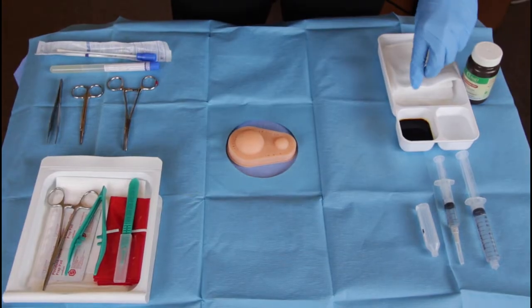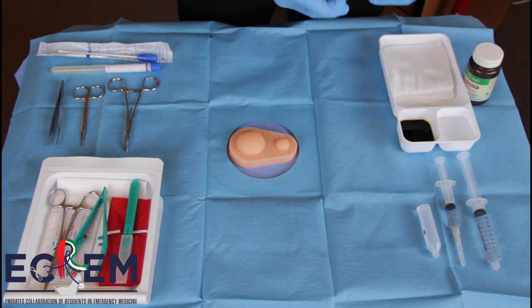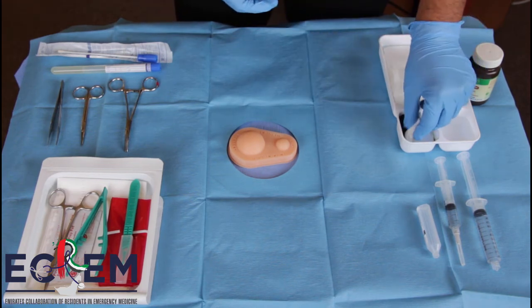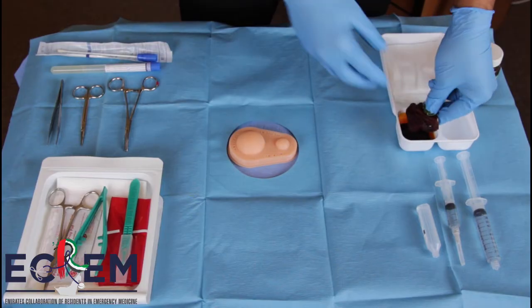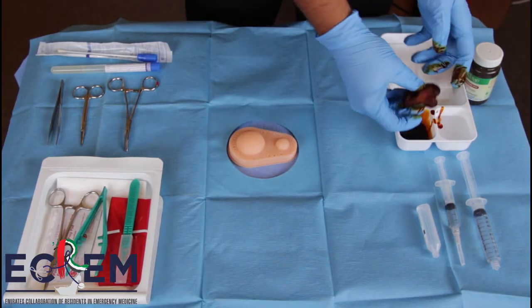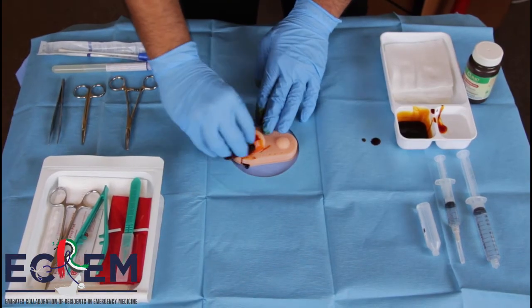We start with the gauze. We make sure it is filled with antiseptic solution, which is povidone iodine. Make sure it is soaked, and now you clean the area well.